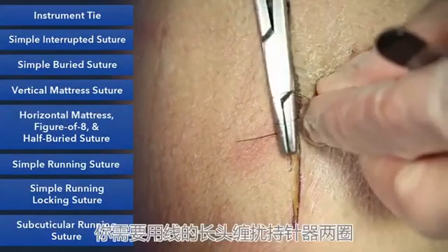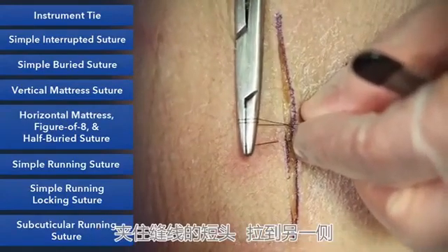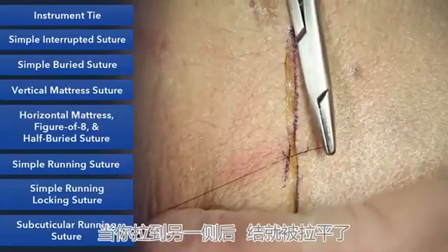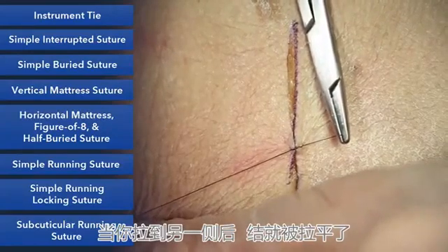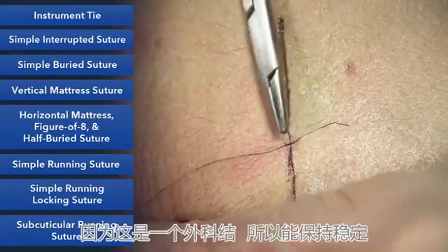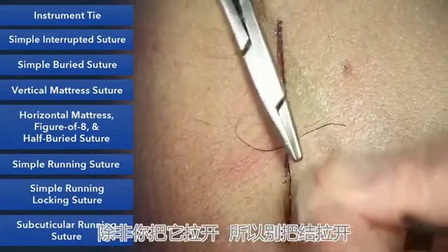You'll wrap the longer end twice around the needle driver, grab the smaller end, and pull it to the opposite side. And what will happen when you pull it to the opposite side, it will square the knot, and you can see how square the knot sits down. Now, because it's a surgeon's knot, it'll sit unless you pull up on it. So don't pull up on it.